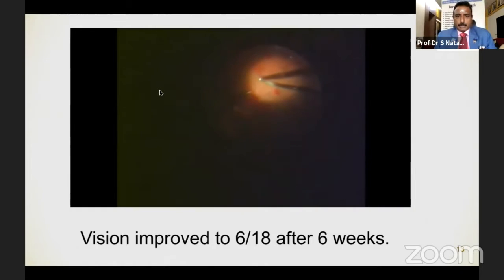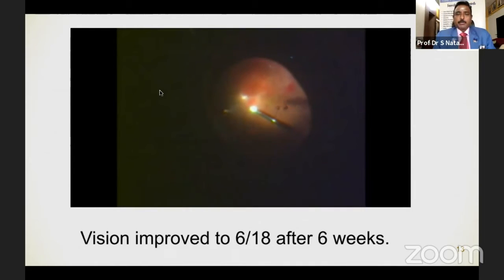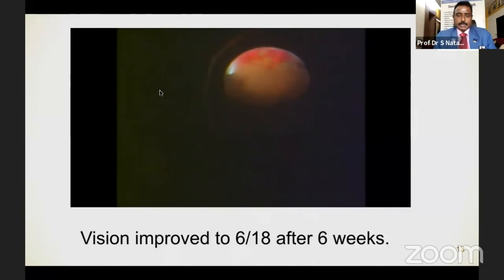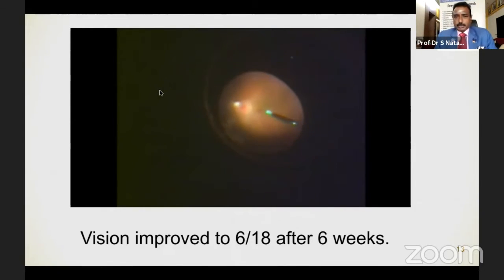Still some retinal hemorrhage happens, which can be cleared using the retinal brush. In the pre-anti-VEGF era, we used to have severe recurrent bleeding as one of the causes for vitreous lavage or fluid air exchange, which is a multiple procedure that needs to be done. Now, giving anti-VEGF pre-op, then vitrectomy with gas and laser, the chance of recurrent hemorrhage is minimized to almost 5%. Even in that 5%, you may not need vitreous surgery, because advanced vitreous surgery, clearing all the traction and making sure good endolaser photocoagulation is done, is actually enough.